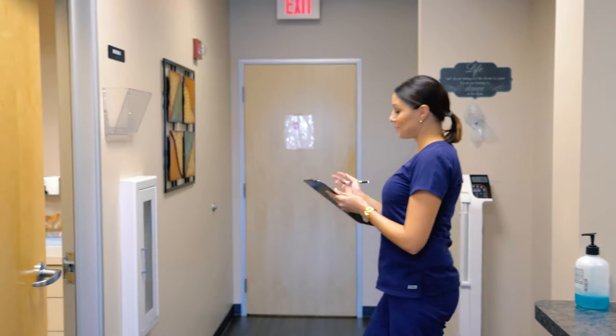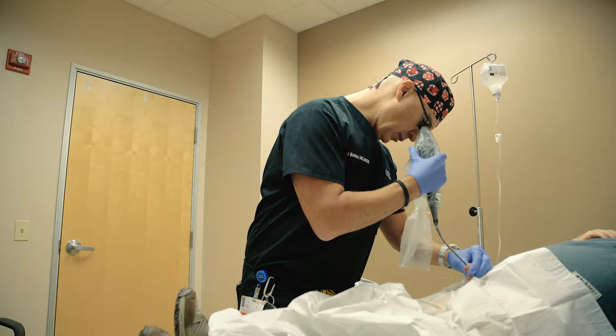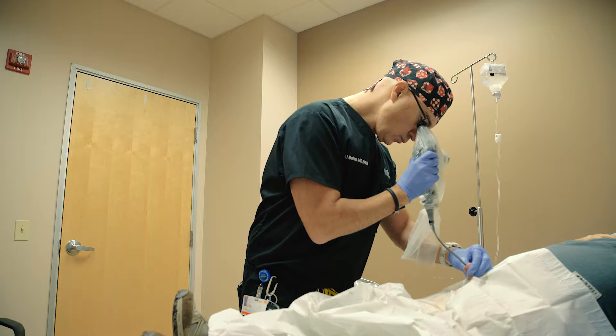The PrimeSight cystoscope with the EndoSheath has allowed us to not have to go through the traditional process of waiting for your other provider to have the scope ready. The mere concept of having to wait 20 minutes or 15 minutes is a nightmare.